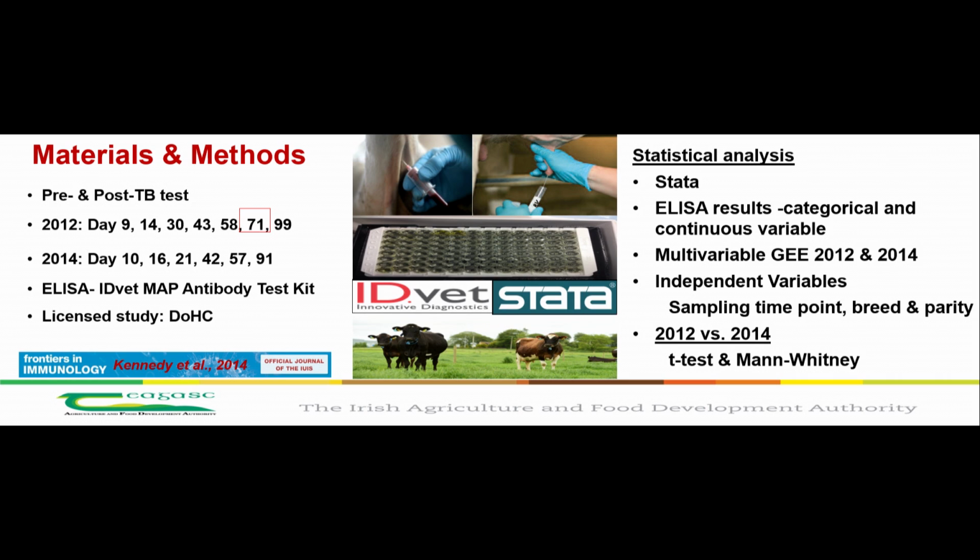Any animal recording an SP ratio greater than 70 was categorised as positive. We analysed our results using multivariable generalised estimating equations, and we included the independent variables of sampling time point, breed, and parity in all models. To analyse the differences between 2012 and 2014, we used t-tests and Mann-Whitney tests.